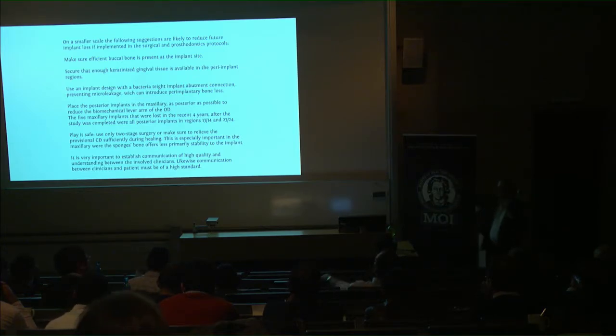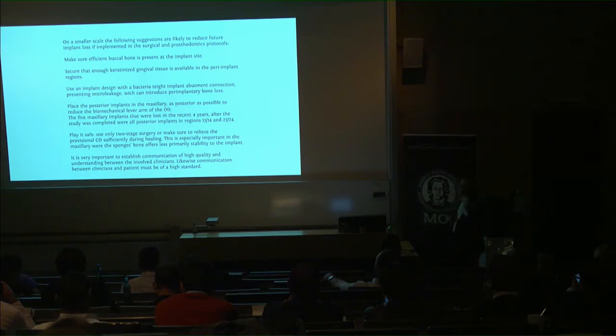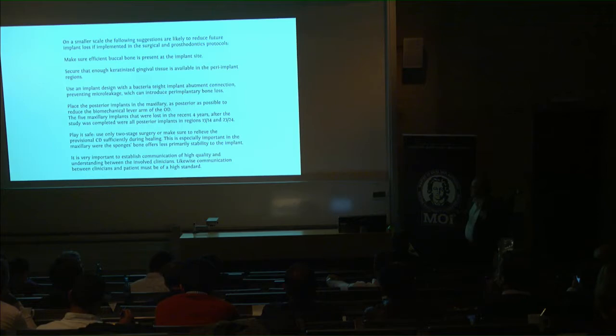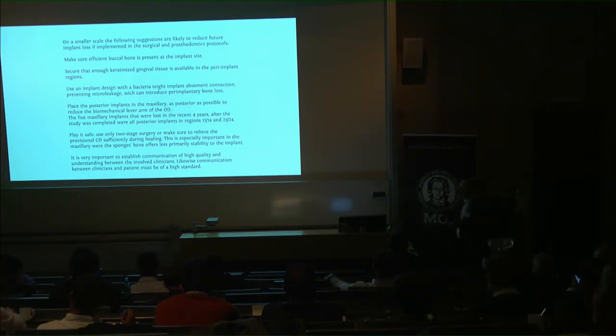The 5 maxillary implants we lost were all due to overloading, really, and were positioned in regions 13, 14, 23, and 24. Play it safe, use only 2-stage surgery, or if you want to make 1-stage surgery, make sure you relieve the provisional denture efficiently. It's very important, and I think that's really the most important thing, to establish a communication of high quality between the clinicians. Usually I do the implant surgery, and another one does the provisional denture. And it's very important that they know they have to relieve the denture.